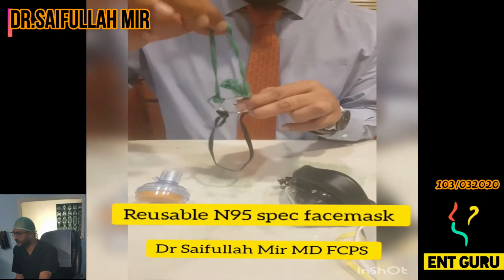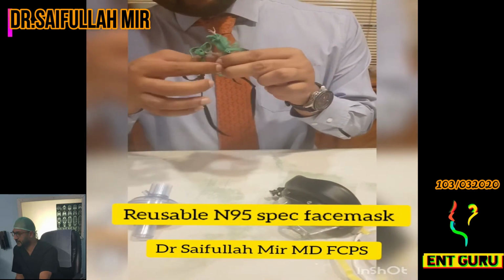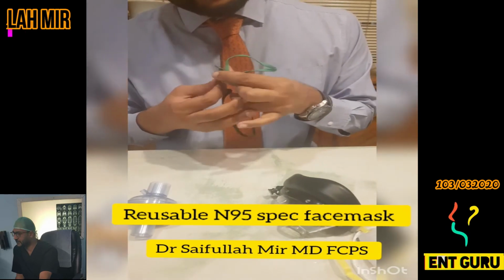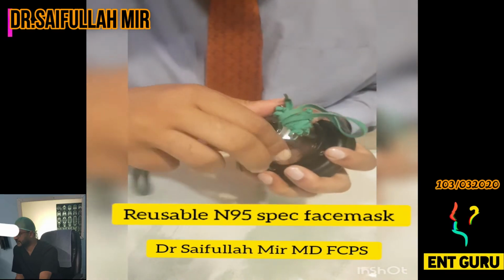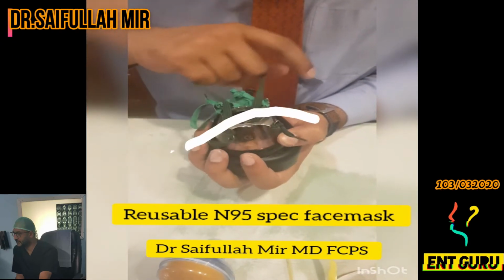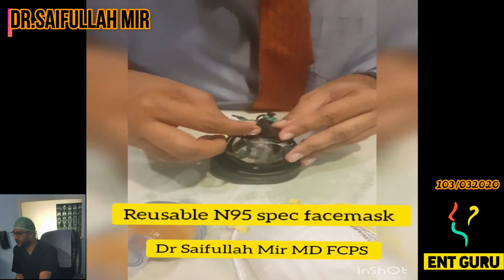Now, as you can see, the light green string is at the top, one, two, and the dark green strings are at the bottom, three and four. They're right next to each other. Then you pull the strings underneath the ring out, then you pull the strings inside the ring and out. Once you've done that, you reattach the strings to the face mask. It's a bit difficult. And you make sure that the strings are going upwards in this direction easily. Right? Once you've done that, you reattach the rubber tubing gently and affirmatively.